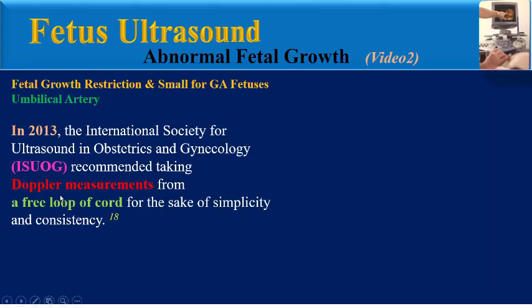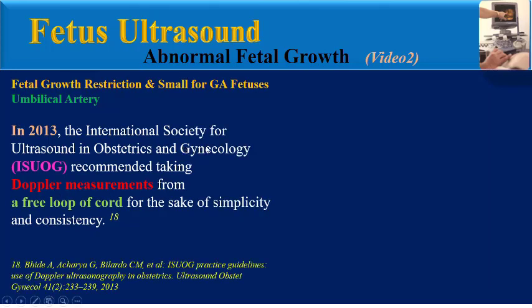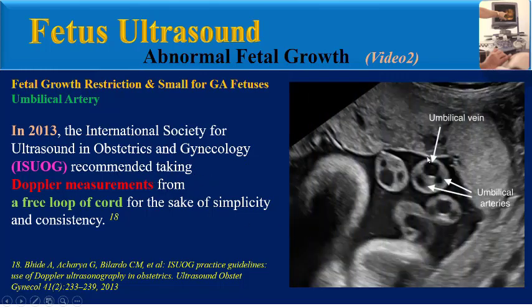In 2013, the International Society for Ultrasound in Obstetrics and Gynecology recommended taking Doppler measurements from a free loop of cord for the sake of simplicity and consistency.